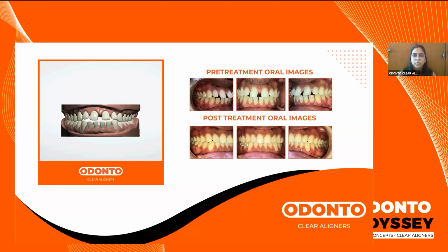Which burr is good for proximal stripping, and which company? For proximal stripping, different burrs are available. They are available either as a kit or individually, as per the size and depending on the kind of proximal reduction which is prescribed. You have burrs for only breaking the contact between two teeth, the initial breakage of the contact, and then you run a second burr which will actually cut it.